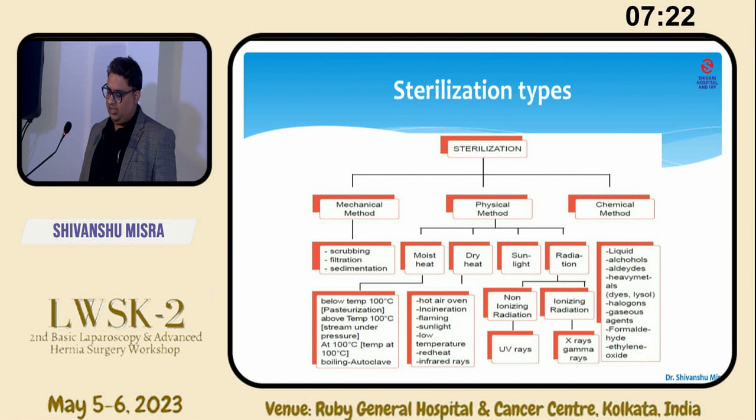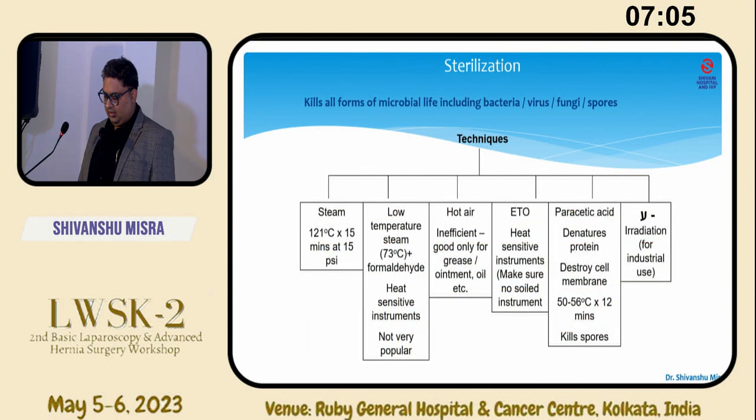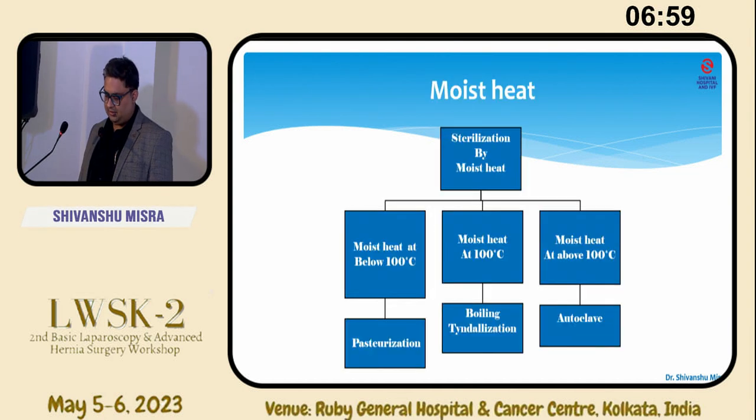Then dry heat can be by hot air oven, incineration, flaming, sunlight, all these things. And then the non-ionizing radiation can be UV rays, and the ionizing radiation can be through X-rays and gamma rays. Then there are other things like ETO, peracetic acid, and radiation for industrial use for sterilization.